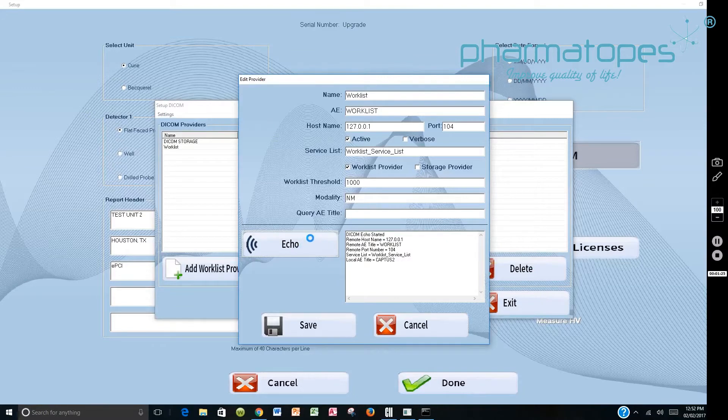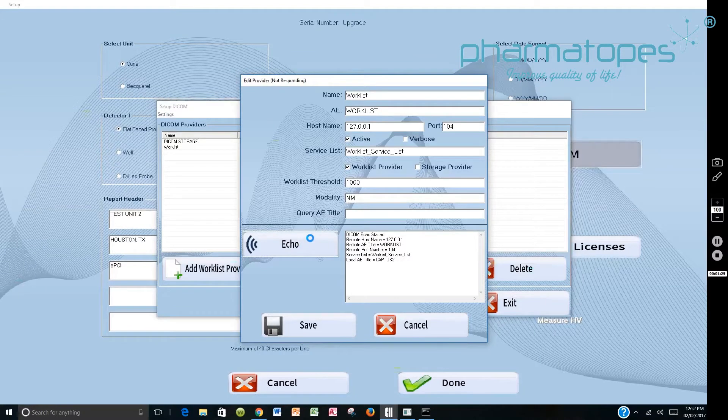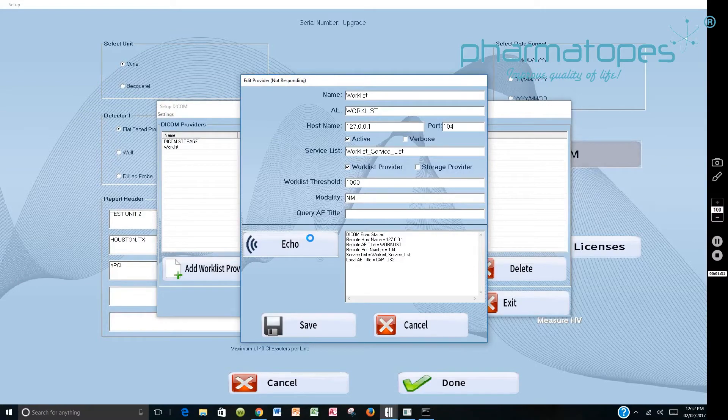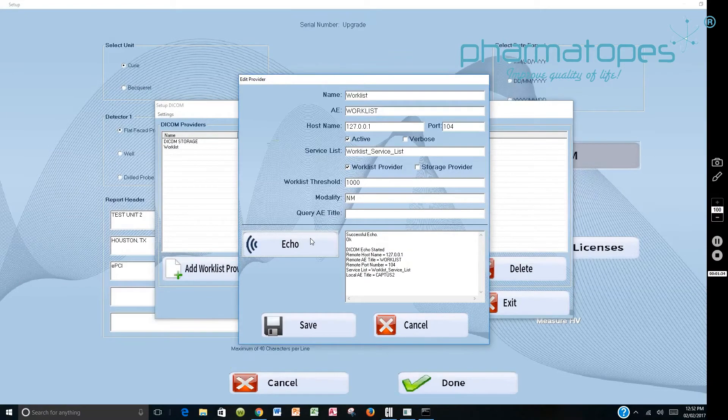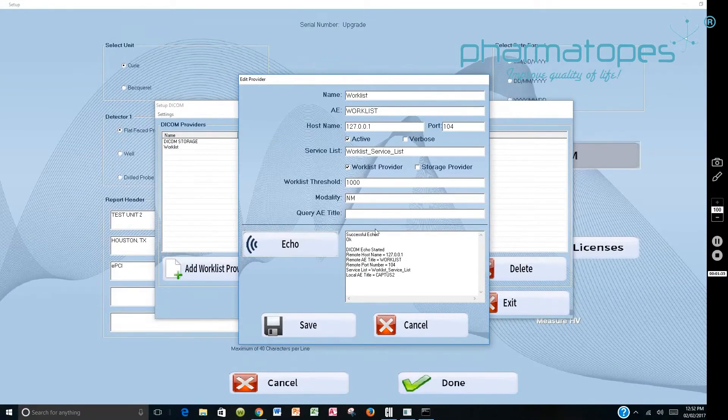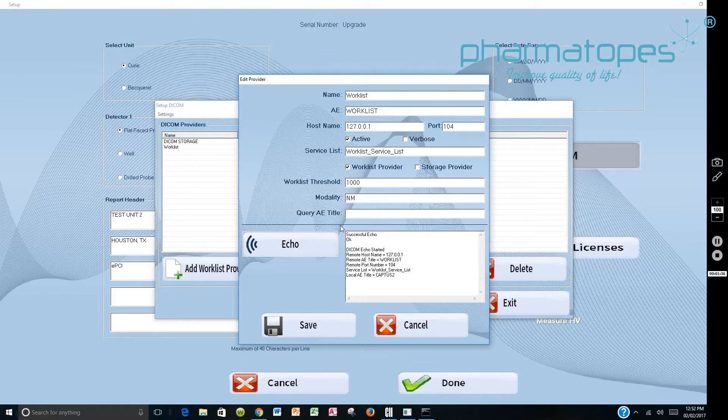You will Echo. It will then communicate with the worklist provider and it'll come back and tell you it's successful. If it's successful, you know that there is communication established and we've got successful Echo. You would save that.